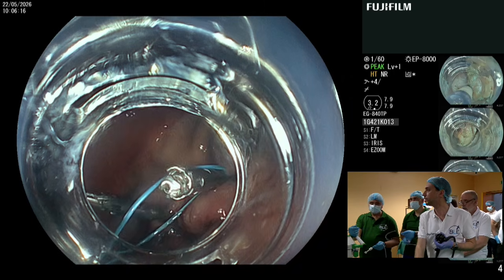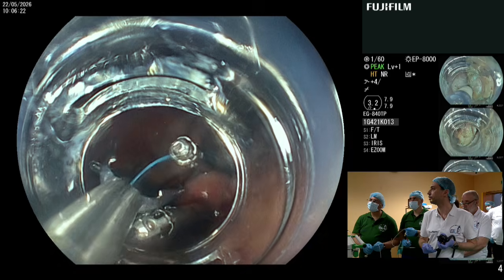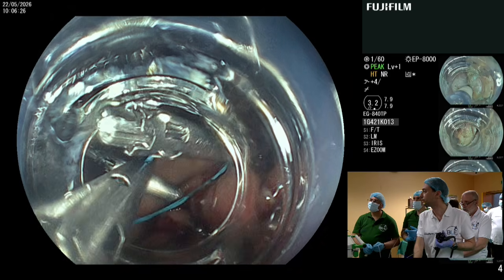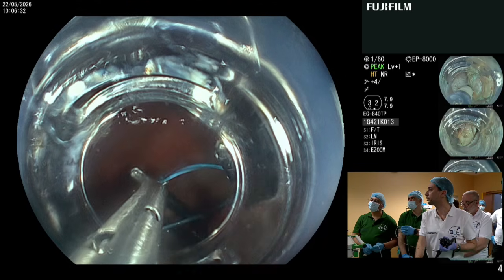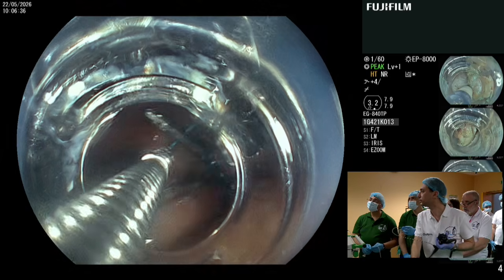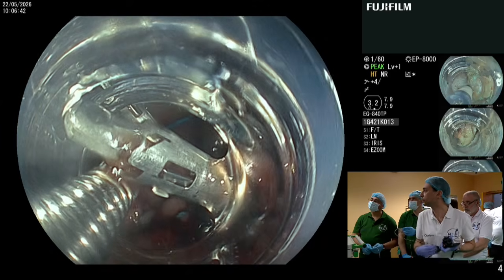So I advance a little bit my loop. Open. All right, great. Close a little bit. All right, nice. Now we need to understand the anatomy here. All right. Nice. I don't see very well. Let's move here.